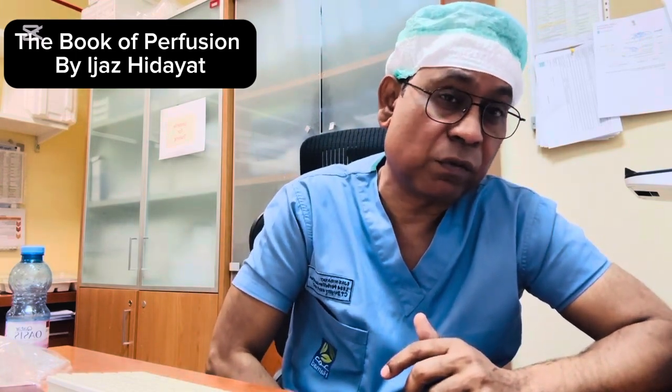Within these 45 minutes you have to go from no flow to low flow, and from low flow to full flow. Within 45 minutes you have to cannulate the patient and connect the patient from no flow to low flow to full flow with the help of your extracorporeal circulation.